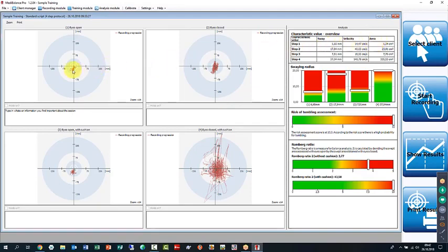And here the area under the curve is calculated. You see the little red dot here, it's just 6 square centimeters. You may have clients with less than 1 square centimeter. If you have a healthy young man, it may be 1 instead of 6 here. And then this one shouldn't be different because eyes open, eyes closed should not have any impact. There usually is a minimal increase.